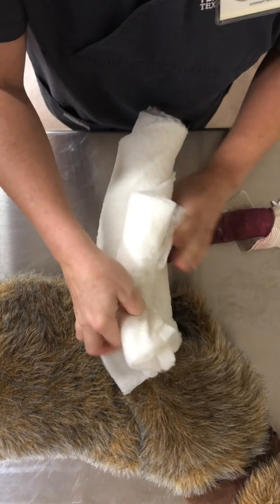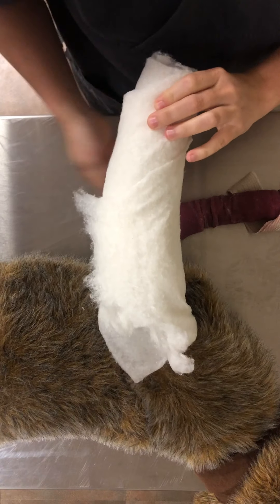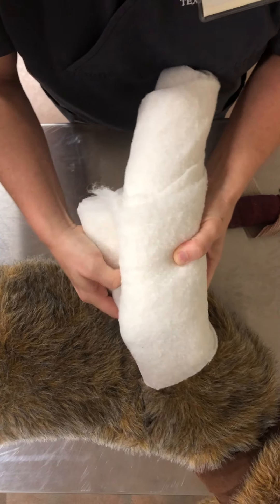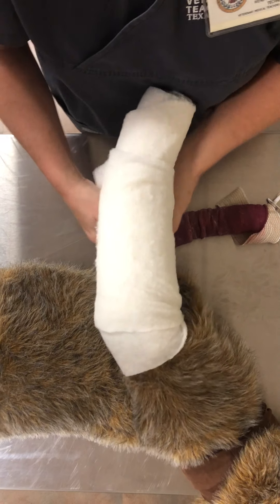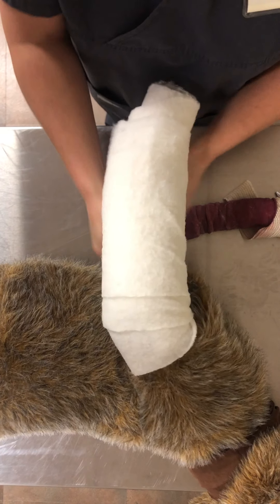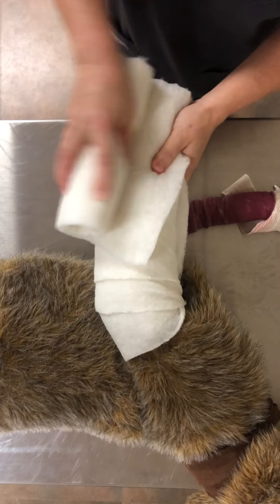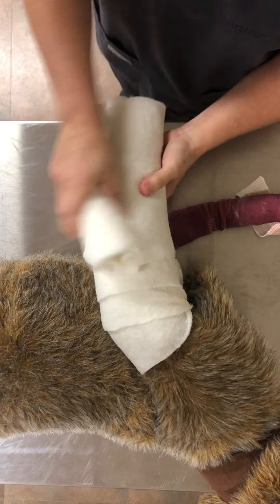We will start with our second half wrap. Pull nice and tight. Make sure when you get proximal, you abduct your patient's limb in order to get your bandage far enough past the elbow to give proper support. Notice this is getting pretty clunky, but we are going to compress it — it will shrink in size significantly. We're going to use one more of our half rolls here for a little dog.